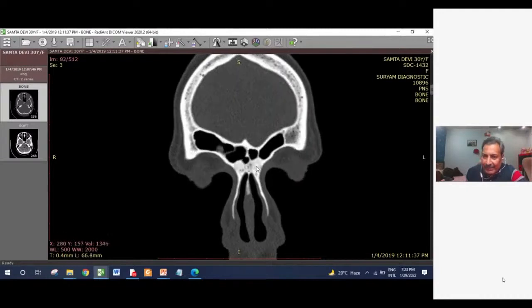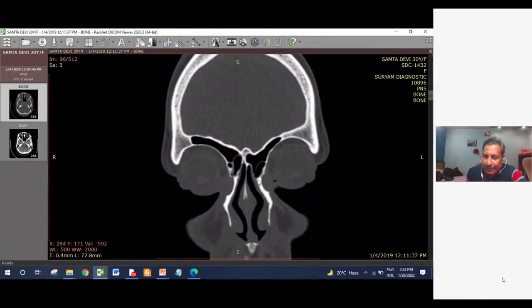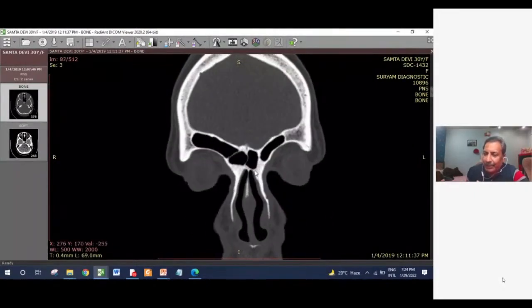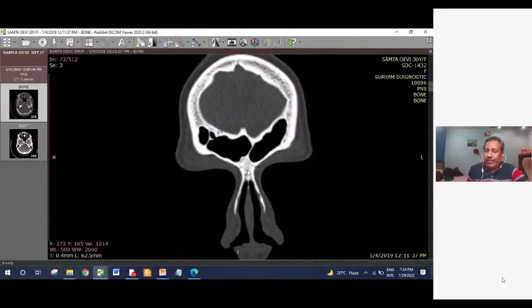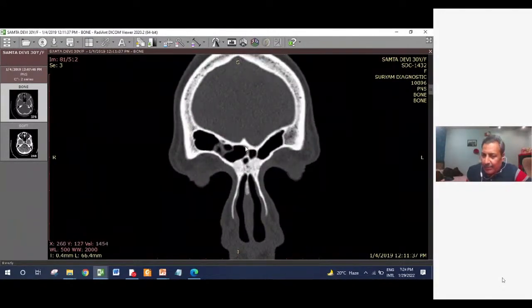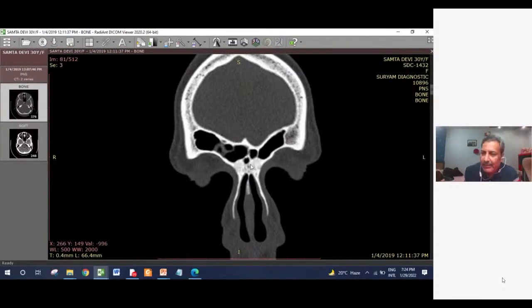See this, as I go behind, the beak is ending, and now the frontal sinus is draining. See this, now no more beak, and the frontal is draining. Now what has gone in between? Now see quickly, I went fast. See quickly what structures come while going from anterior to posterior. The first pneumatization which comes as you go behind in the paranasal sinuses after the frontal sinus is the intersinus septal cell.